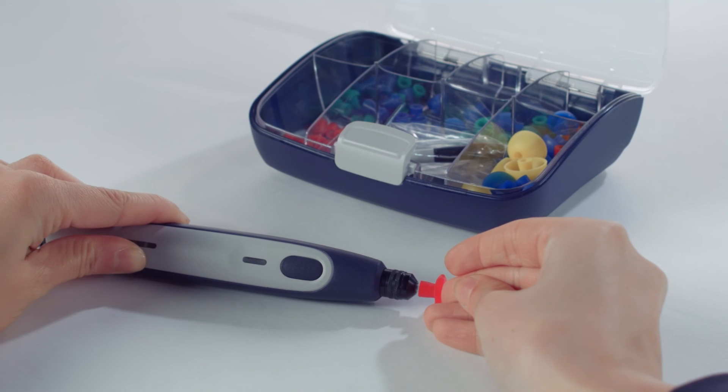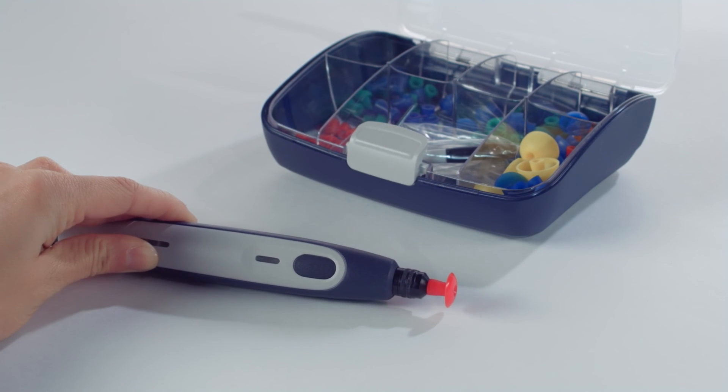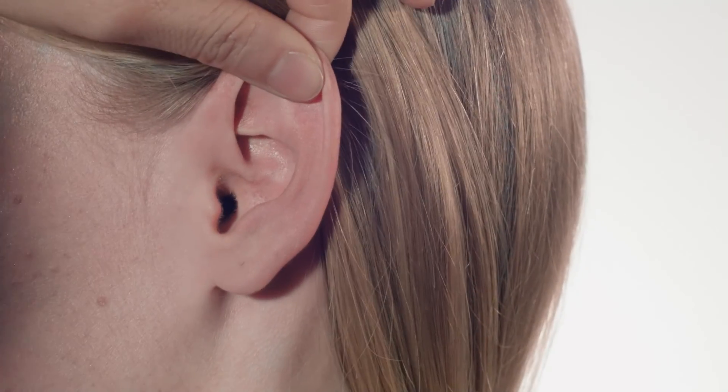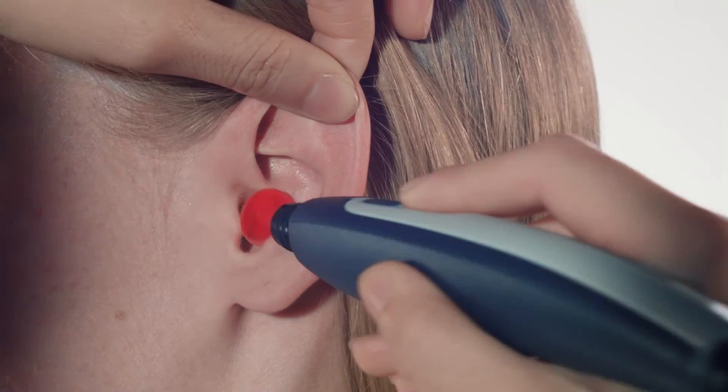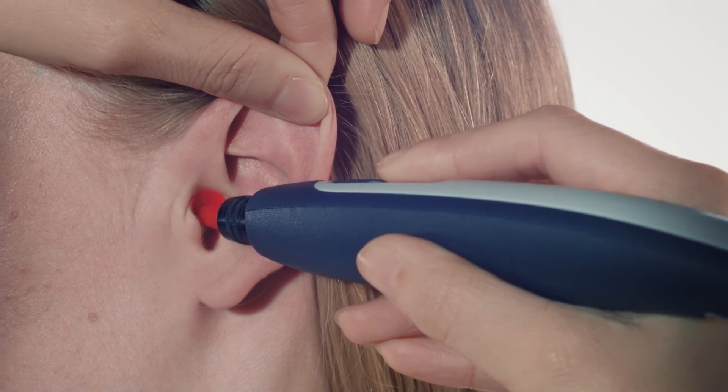When placing an ear tip on the probe, make sure the ear tip is pushed all the way down on the probe tip. Gently pull the ear up and back for adults or down and back for infants to straighten the ear canal. Hold the probe in place, applying slight pressure so a seal can be obtained throughout the test.